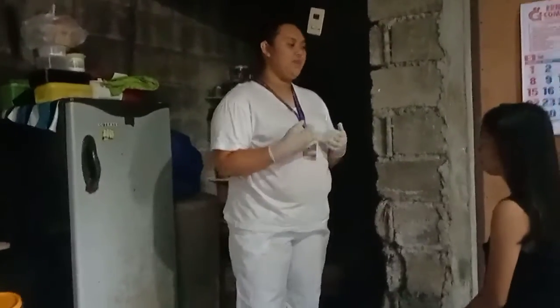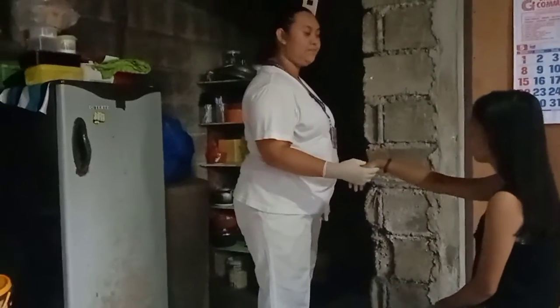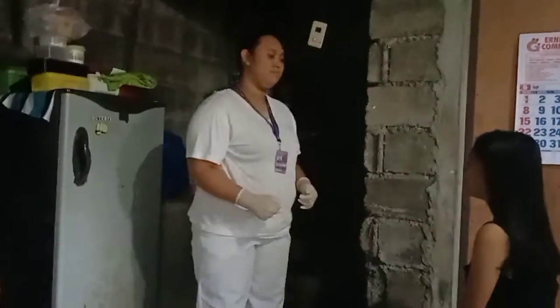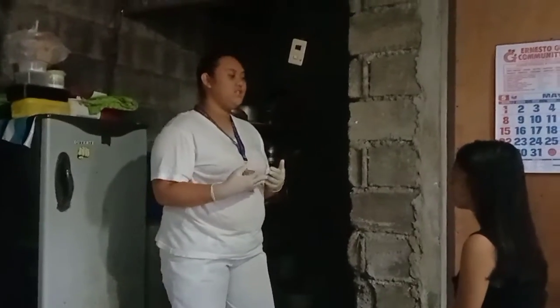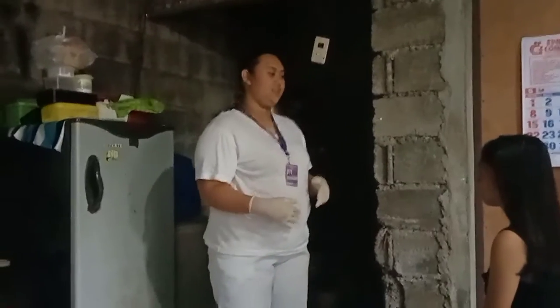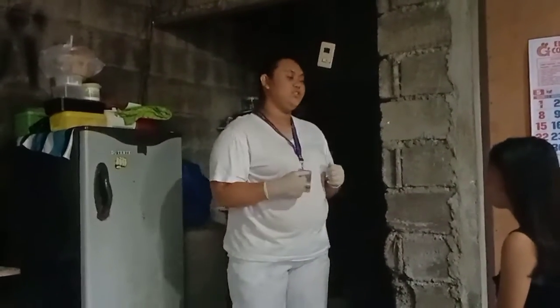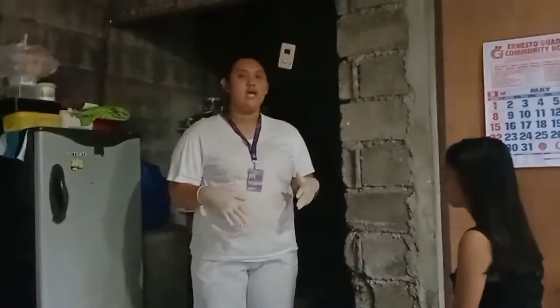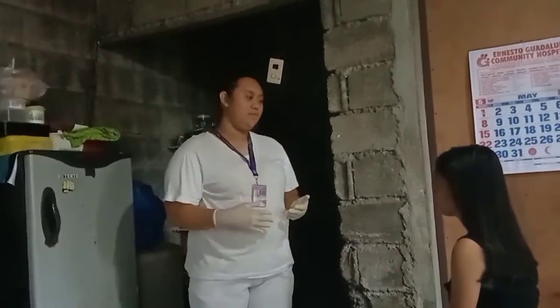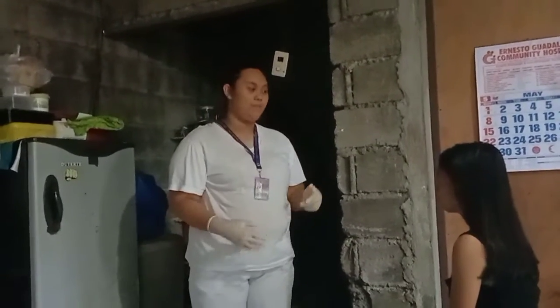So, okay, ma'am, I'm your nurse today. Please state your complete name and birthday, please. Okay, how would you like me to call you? Do you have any questions or clarifications? If you have any questions or clarifications, don't hesitate to raise them, okay? By the way, the procedure that I will be doing is a subcutaneous injection. So I'm going to administer the medication using the injection under your skin, okay?